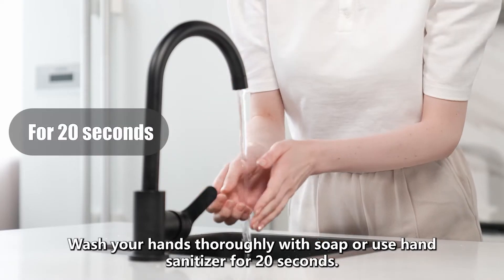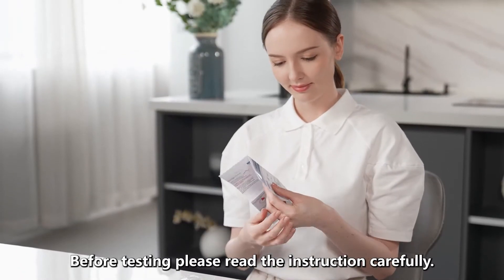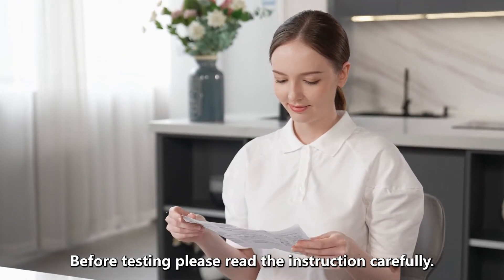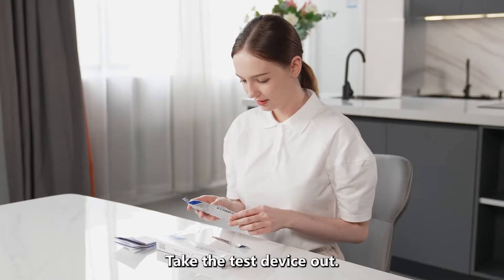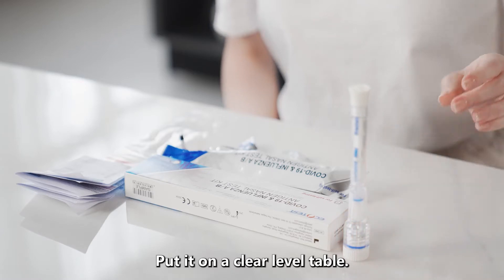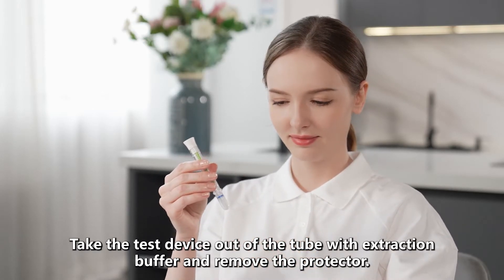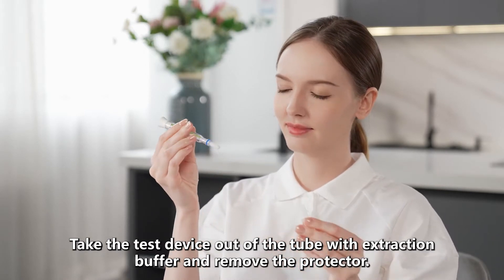Wash your hands thoroughly with soap or use hand sanitizer for 20 seconds. Before testing, please read the instructions carefully. Take the test device out and put it on a clear, level table. Take the test device out of the tube with extraction buffer and then remove the protector.